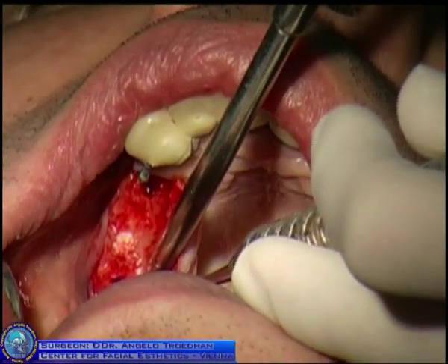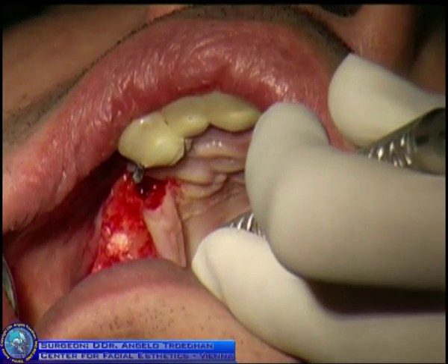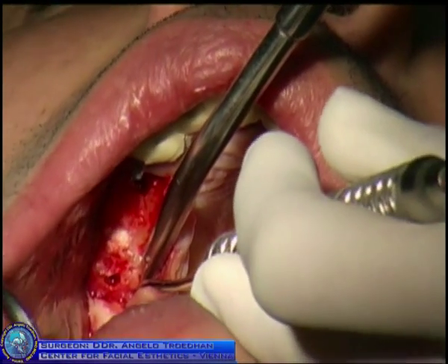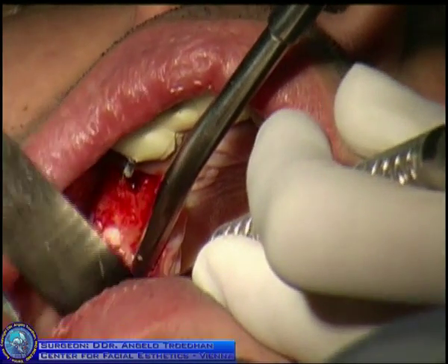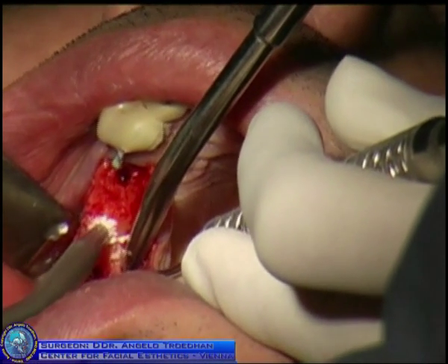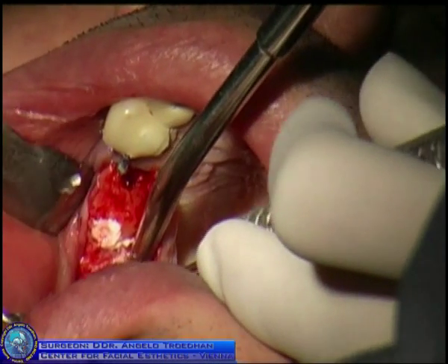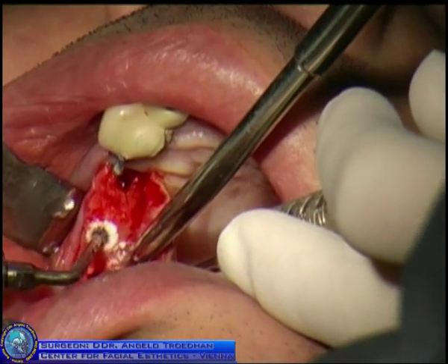Okay. Sometimes, just a moment, please. Sometimes when you start to feel that the resistance of the bone graft inserted is very high, which actually is the case now, we use the plug and spray method.